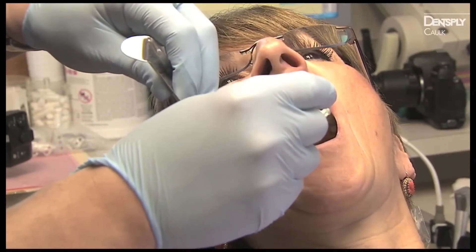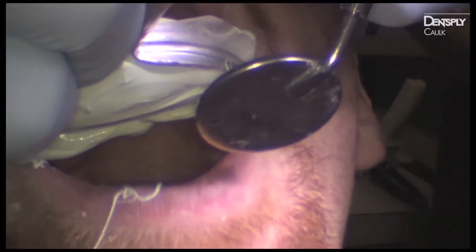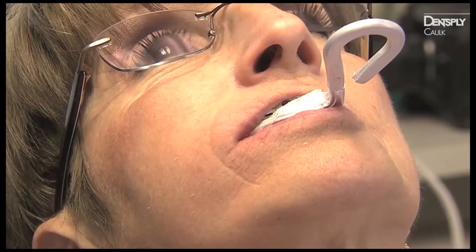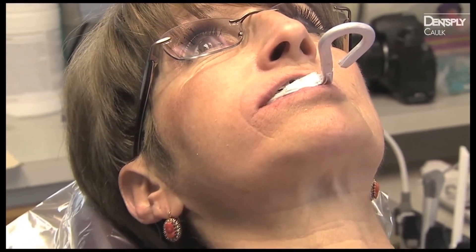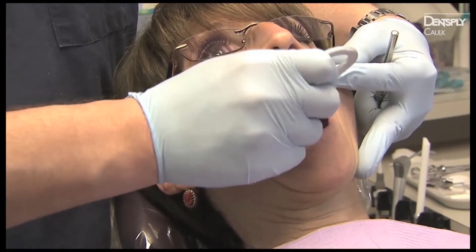Place the Aquacill Ultra Cordless tray impression material into the mouth no later than 35 seconds from the start of syringing for a single unit, or one minute from the start of syringing for a multi-unit. Both cartridge fill levels are designed to be fully expressed within this timing to ensure work time is not exceeded.